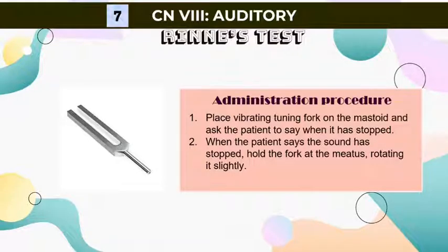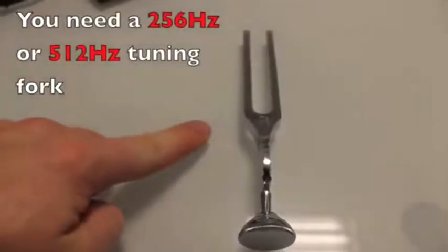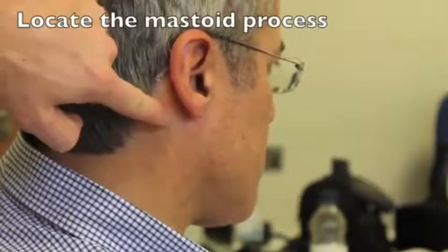The second test for the auditory nerve is the Rinne test, and the tool is a tuning fork. Here is the administration procedure. For the next part of the test, you will require a 512 or 256 Hz tuning fork. To see which Hertz tuning fork you have, look at the base and the number will be located here. This is a 512 Hz tuning fork. To activate the tuning fork, you should ping it, like so, or you can tap it on your knee. The mastoid process can be located here.